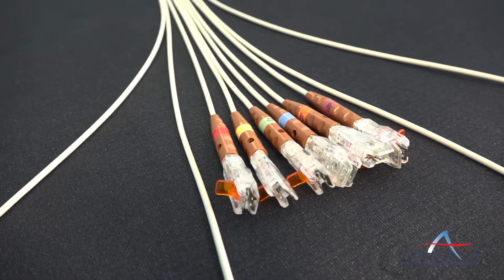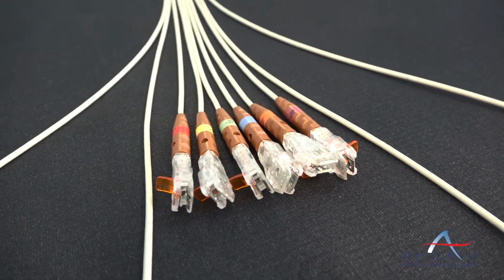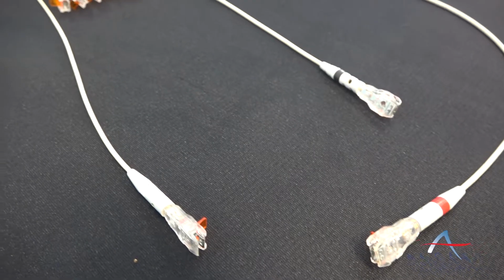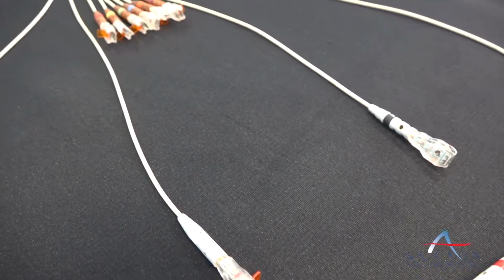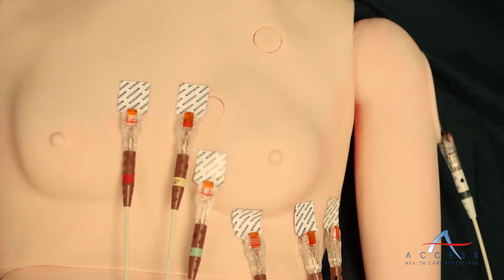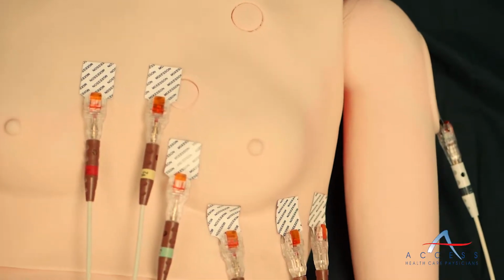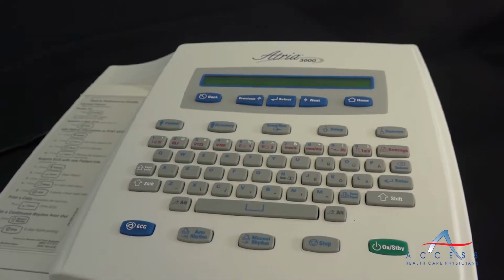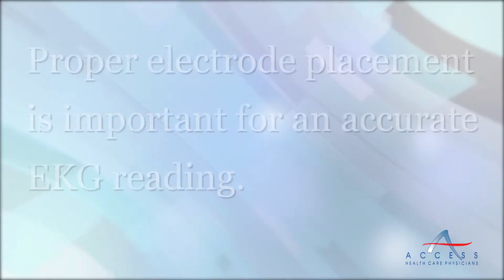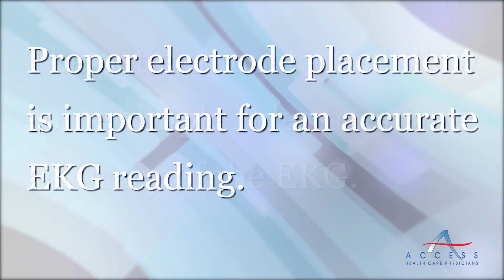The 12-lead EKG paints a picture of the heart's electrical activity by recording information through 12 different perspectives. Think of it as 12 different points of view of the same event that's woven together to tell a cohesive story, known as the EKG interpretation. These 12 views are collected by placing 10 electrodes on the patient's chest, arms, and legs. These electrodes are connected to a machine that registers the heart's activity. To measure the heart's electrical activity accurately, proper electrode placement is crucial.